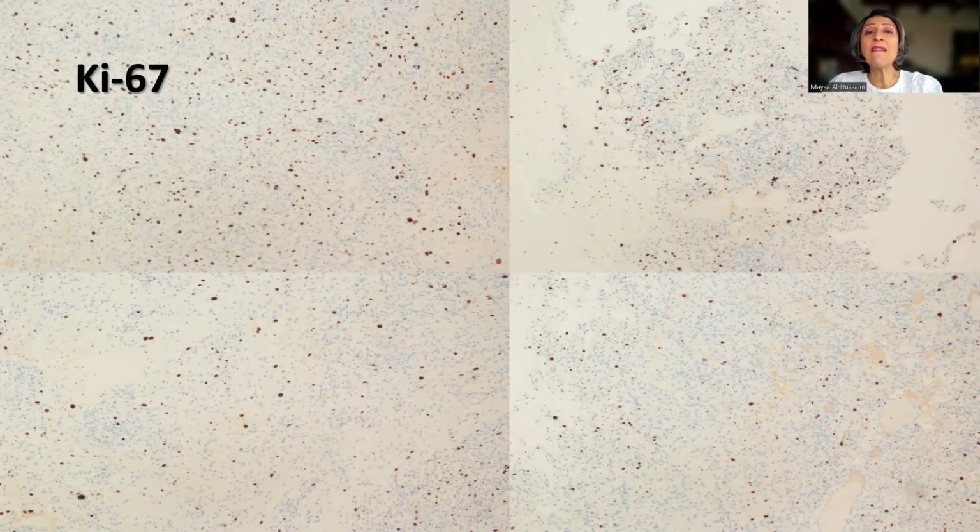What I always do actually with meningioma is Ki-67. And Ki-67 tends to show this variability of immune staining. There are hotspots, there are less positive areas. So it's really important to locate your hotspots for 2 reasons. Number one is that there is some evidence that if Ki-67 is more than 4% in meningiomas, in hotspot, these meningiomas tend to behave like atypical meningiomas. So this is number one.